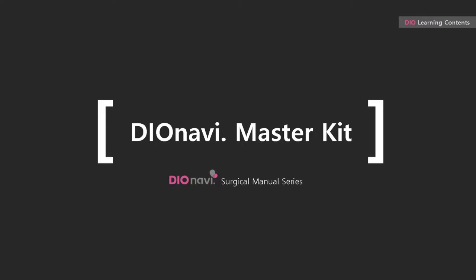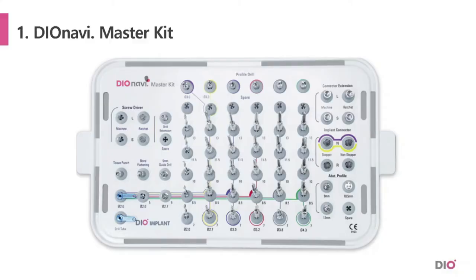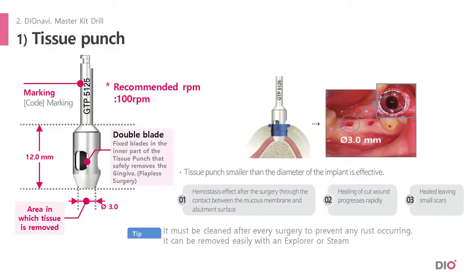Today we will go over the DIOnavi Master Kit. This is the DIOnavi Master Kit. Let's take a look at the drills one by one. When you receive the protocol, you will have to use the tissue punch first.